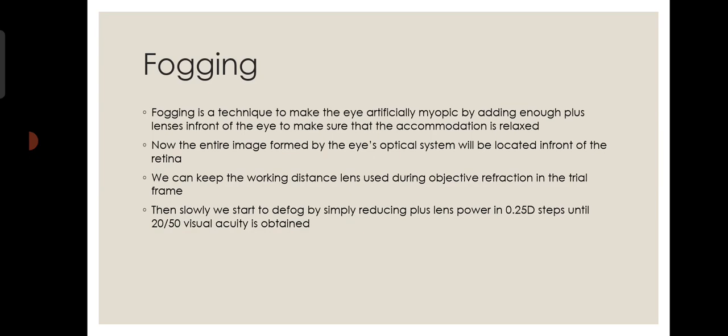For relaxing the accommodation completely, we do fogging. Now, how to do fogging? Fogging is a term all of you have heard. We need to fog the patient to give the correction lenses. So let me talk about it.